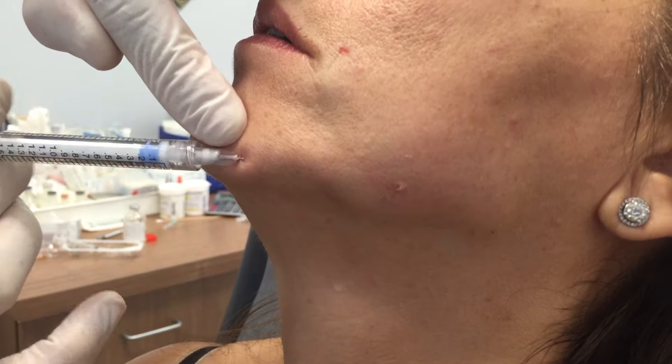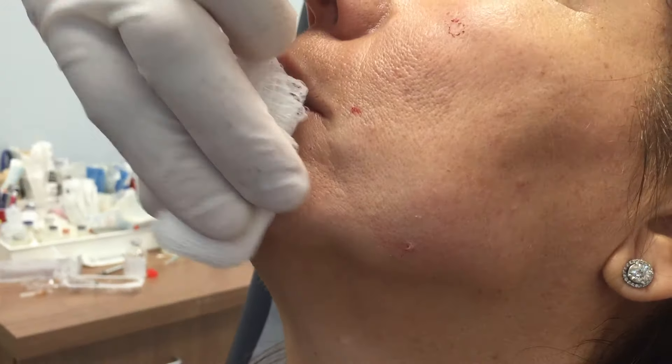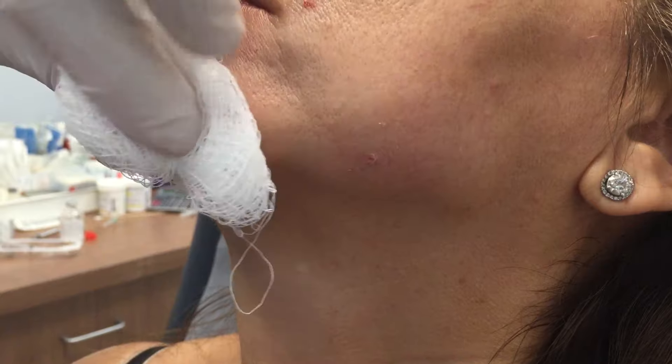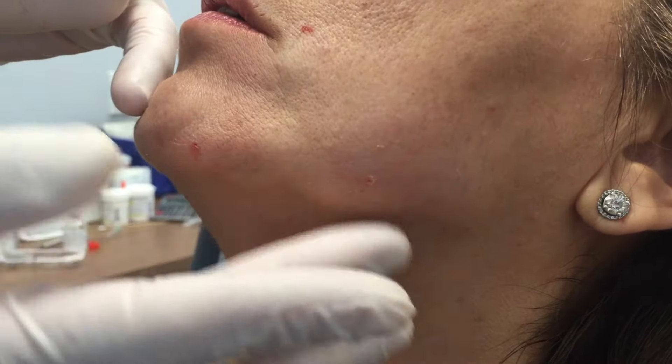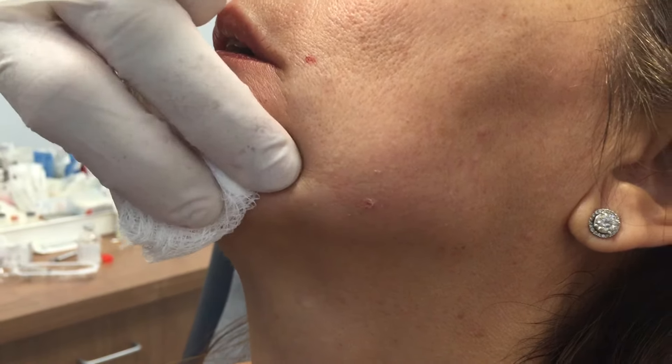I love Radiesse — it's very moldable and I blend it down with some lidocaine. If you pull back just a little bit, you can see how this area camouflages where that jowl is. You get a fill before and after it, so it's not going to make the jowl disappear, but it's certainly going to improve the appearance of it.